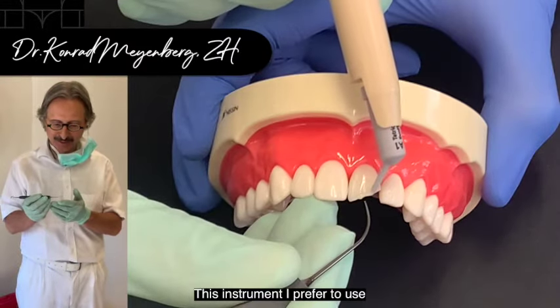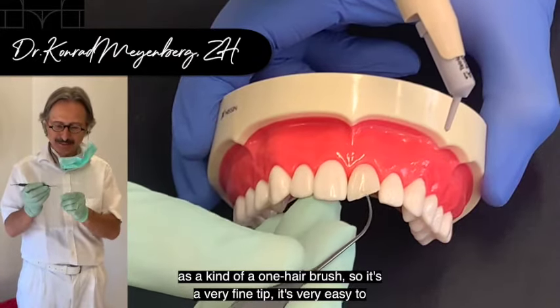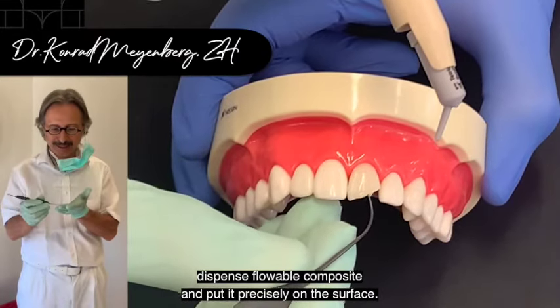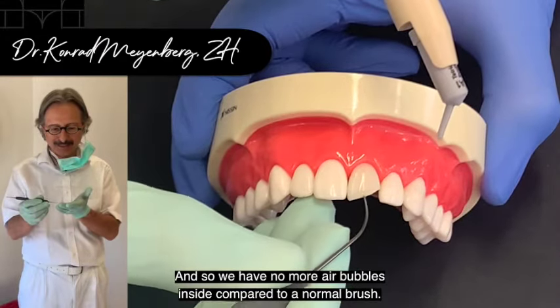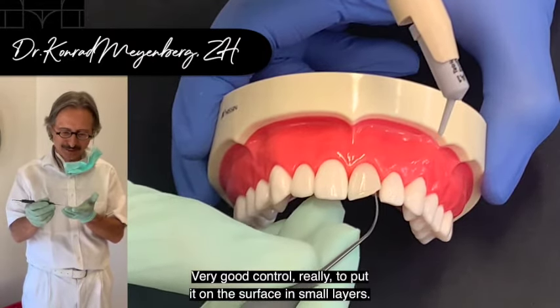This instrument I prefer to use is kind of a one-hair brush. It has a very fine tip, so it's very easy to dispense flowable composite and put it precisely on the surface. We have no air bubbles inside compared to a normal brush, and we have very good control to place it on the surface in small layers.